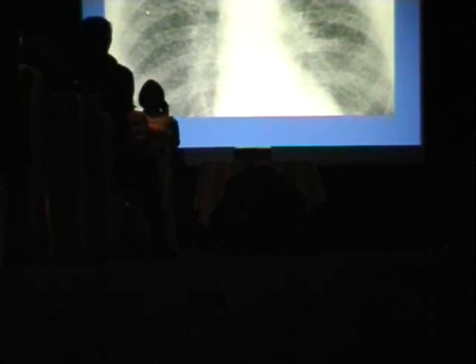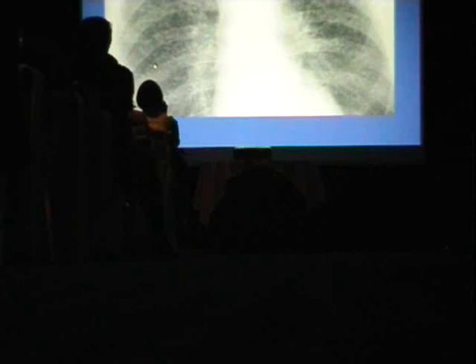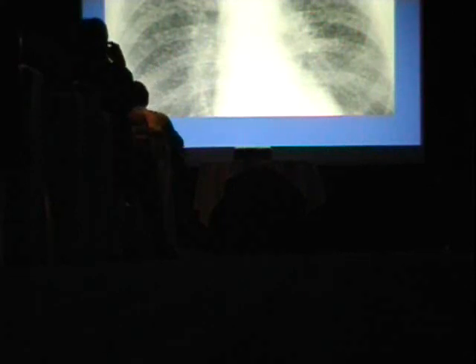Now let's look at some nodular patterns, starting with standard radiographs. This case shows disease predominantly in the upper two-thirds of the chest with a diffuse nodular pattern. The nodules are about 3 to 4 millimeters, pretty well-defined without irregular borders, and the disease is much more prevalent in the upper and mid-lung zones with the bases relatively spared. This is very classic for simple silicosis — the right history, right geographic area, this size nodule, and upper lobe/mid-zone distribution.